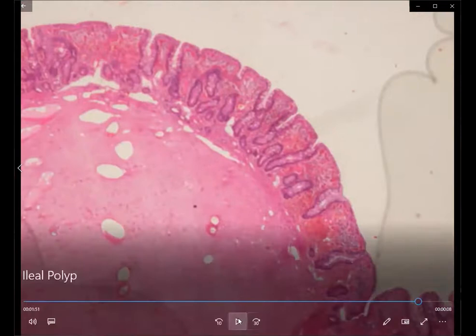And the next thing that we should know is that these inflammatory fibroid polyps are basically in the submucosa, and they have no relation with the muscularis propria. So basically the muscularis propria will be intact, but this is just a proliferation occurring within the submucosal region, and thereby it is causing the expansion of the submucosa. And these will also be accompanied by a little inflammatory cell infiltrate.